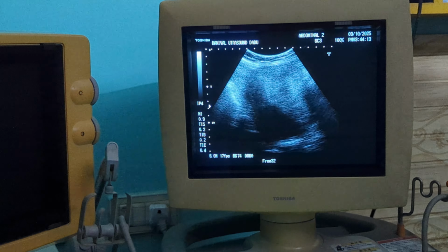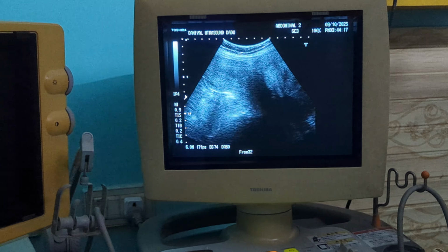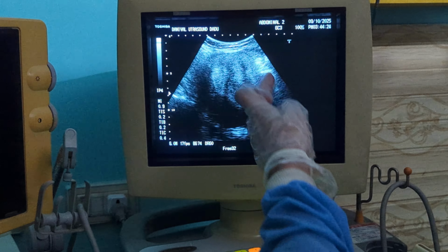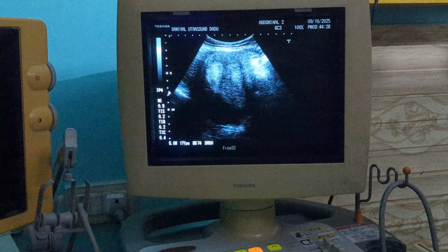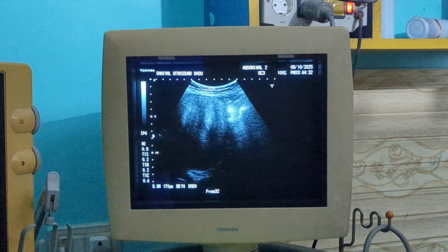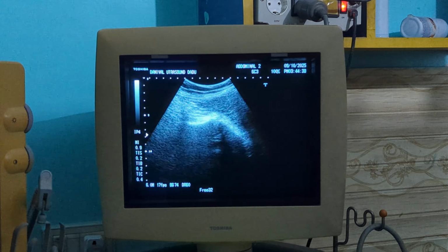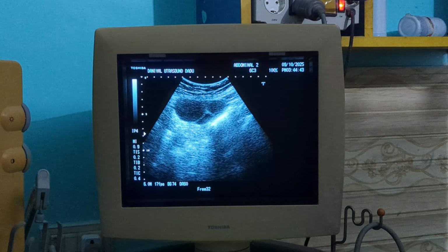Again, I show you here is the uterus, which is moderately enlarged and showing a bulky appearance. The anterior surface, from the body and the cervical area, is all overlapped by the echogenic complex mass, showing echogenic areas inside which are casting posterior acoustic shadowings. This is located in the left adnexal area. So I also told you about the DD.